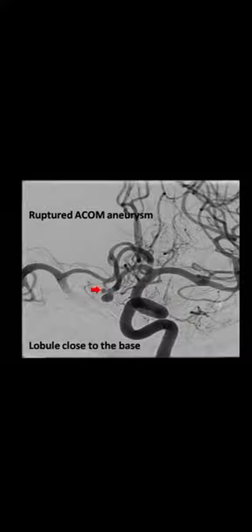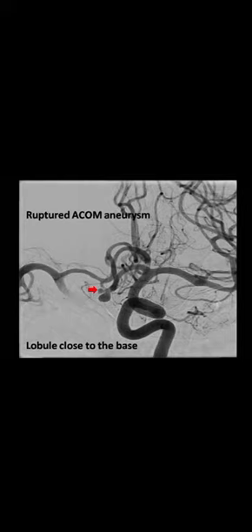Dear friends, we present a case of ruptured ACOM aneurysm near the neck lobule and the technique we used in this case. This patient had this anterior communicating artery aneurysm filling from the left side and near the neck lobule. This is the other view showing in the 3D.